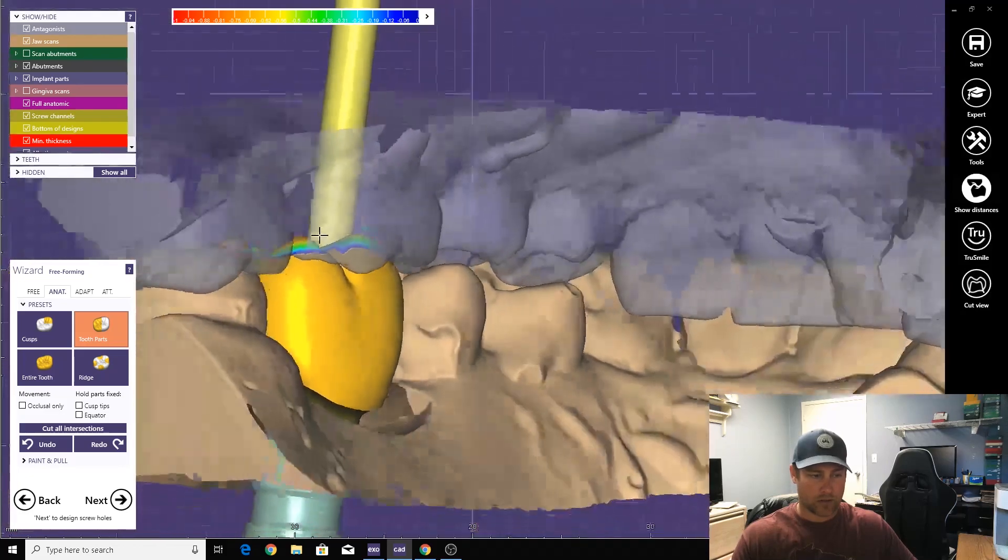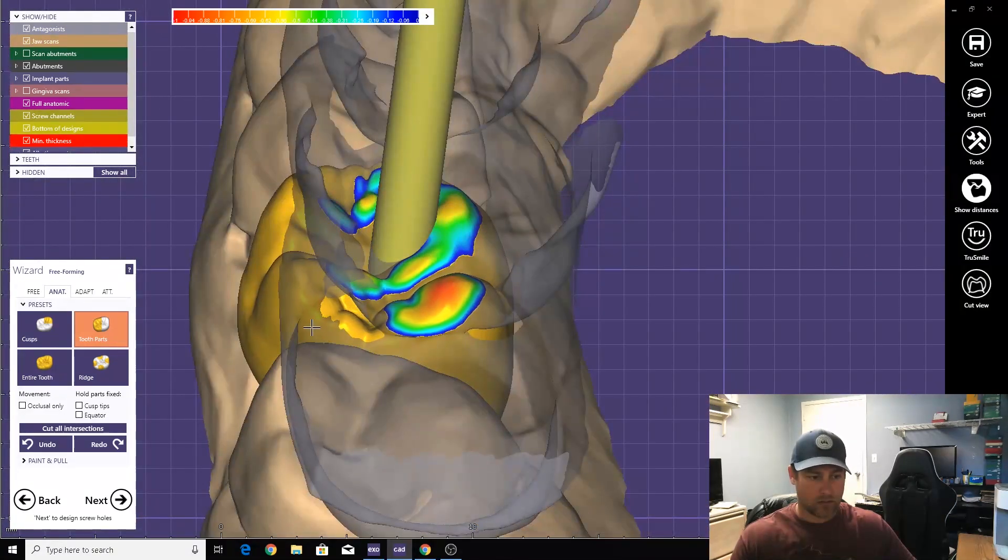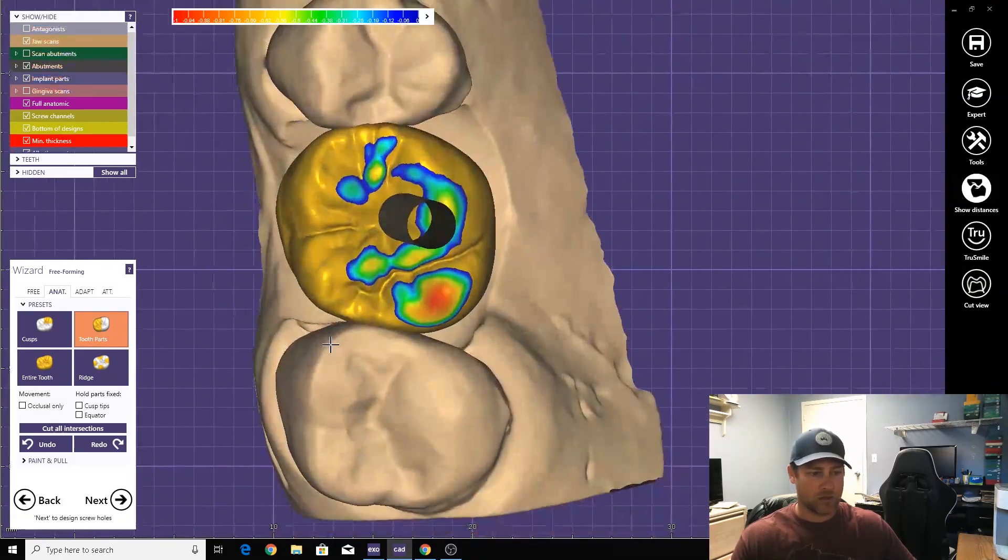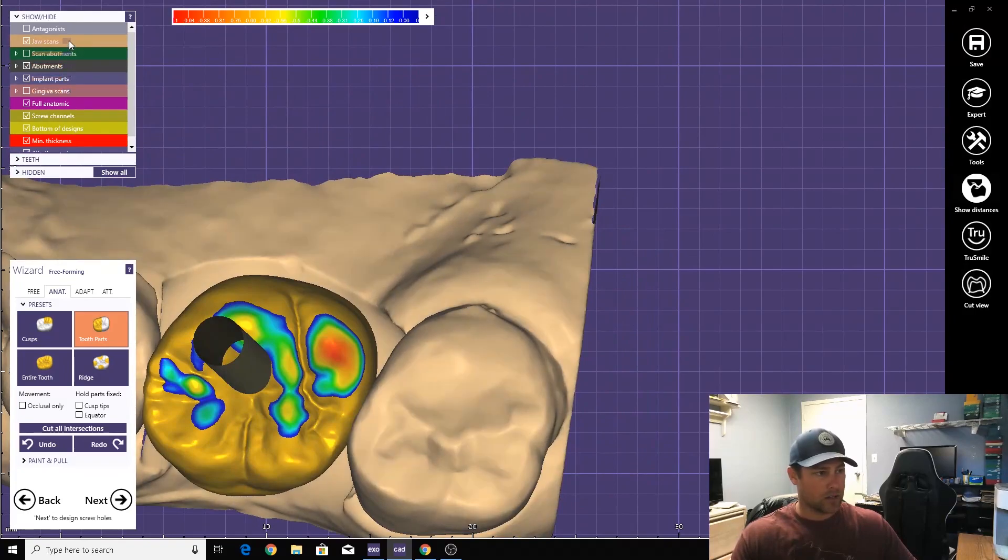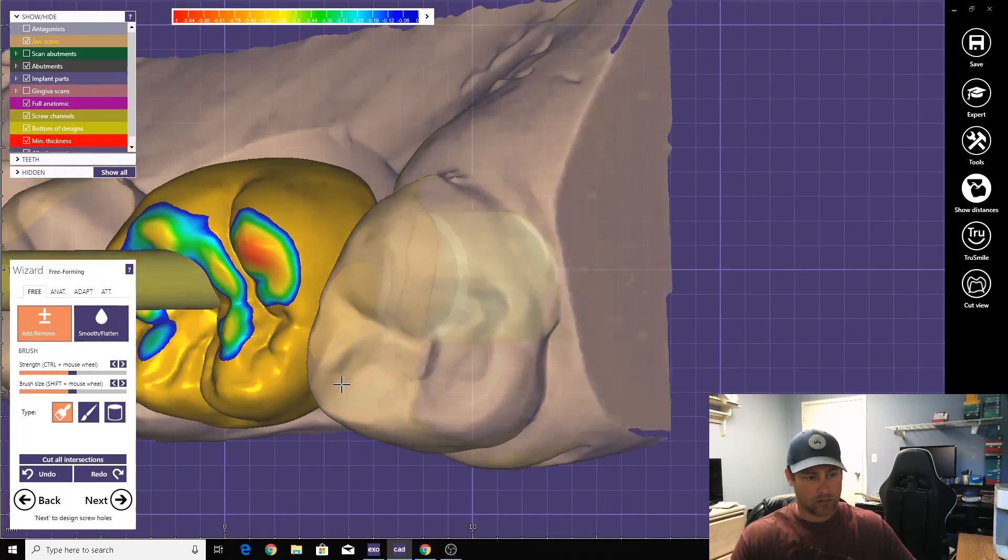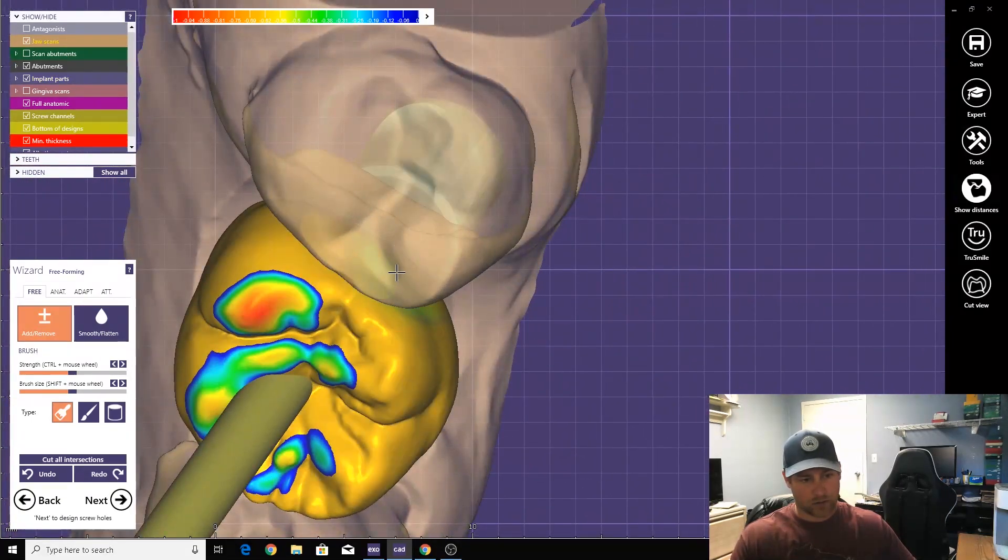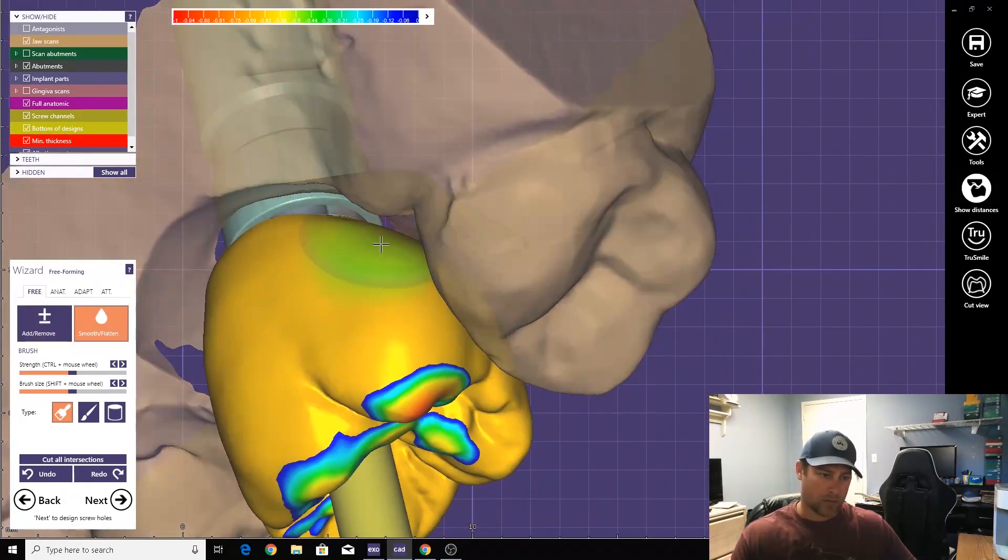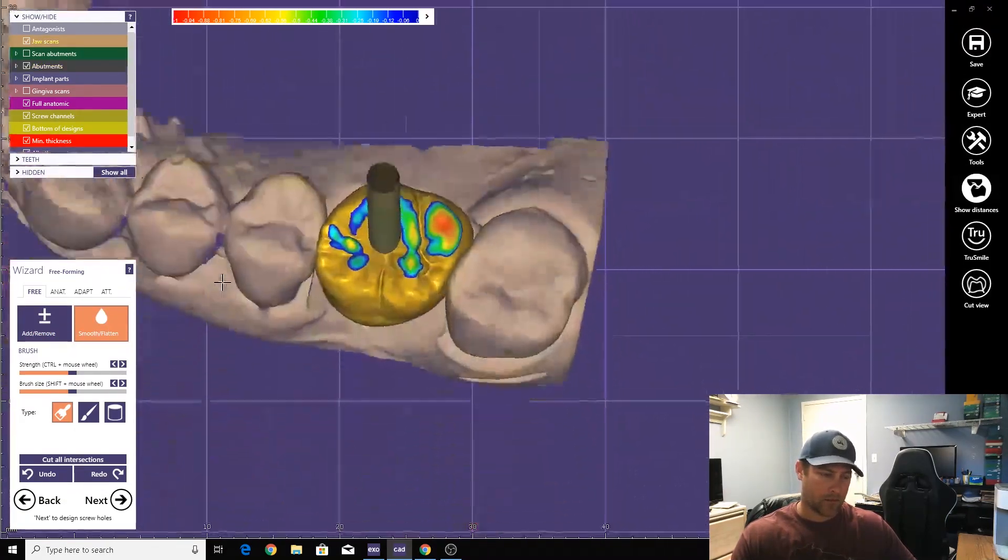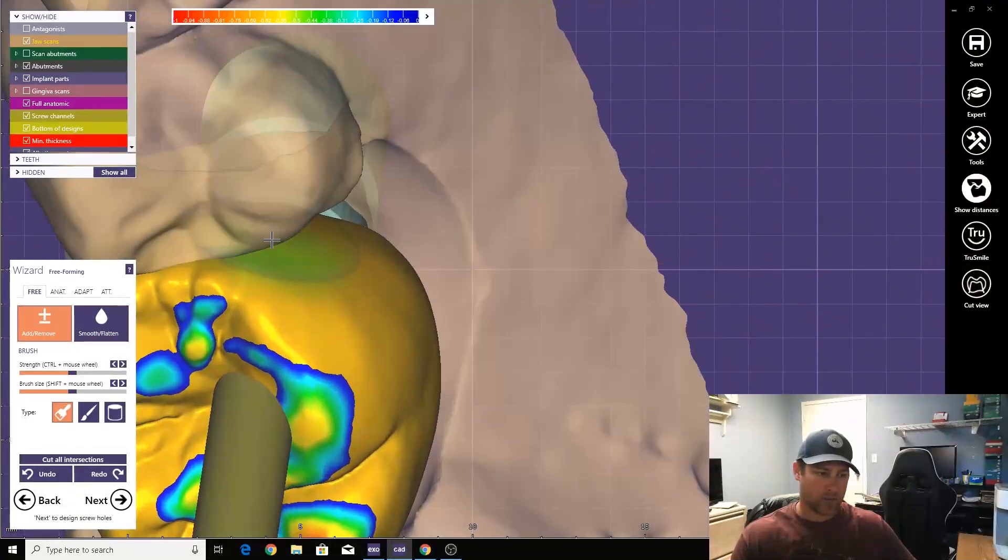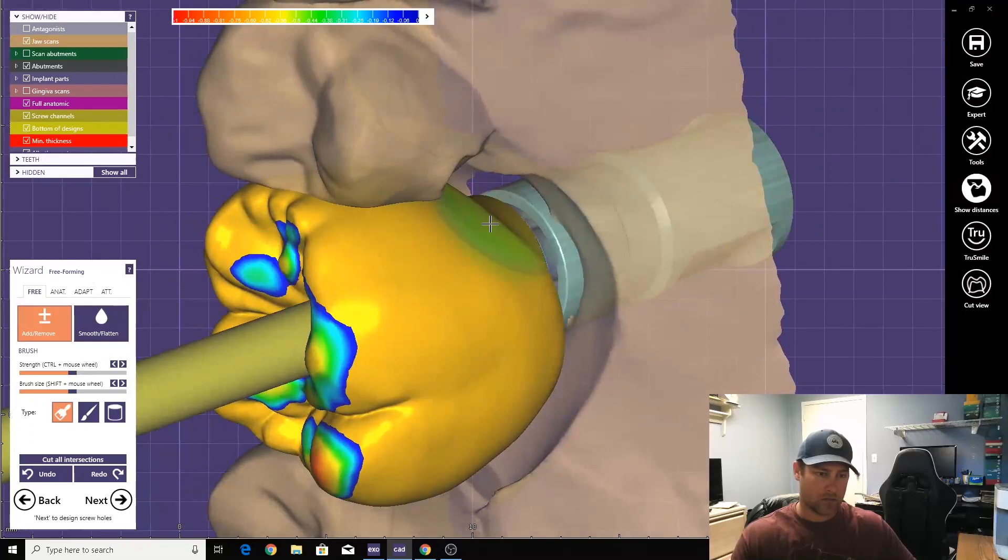And then just design your tooth like you would normally design any other crown. Stick this up in there, stick this up in there.